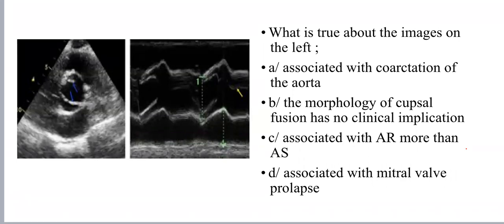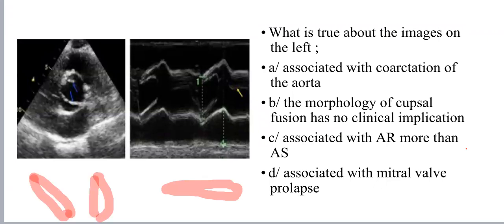One of them causes dilatation of the aortic root. Very good. That's so good of you. Thank you so much. In the end, what we usually get is the slit. The slit in bicuspid can be like this, horizontal, can be vertical, or can be oblique, right? According to the cuspal fusion, the morphology of the opening will be horizontal, vertical, or oblique, each of which has a different influence on the progression of aortopathy.